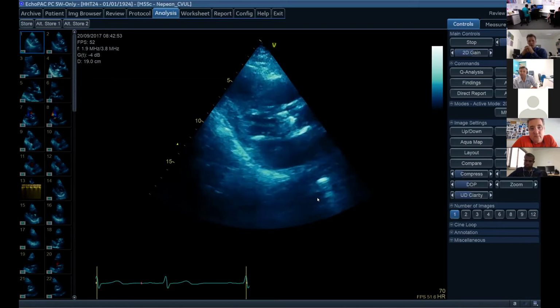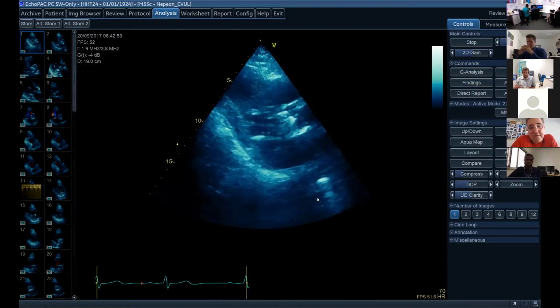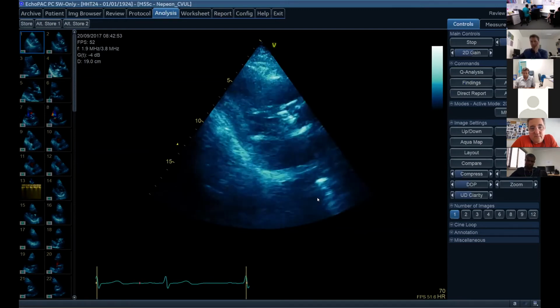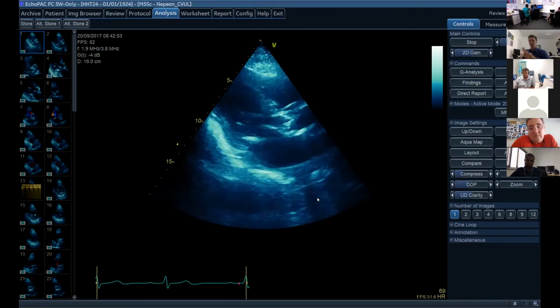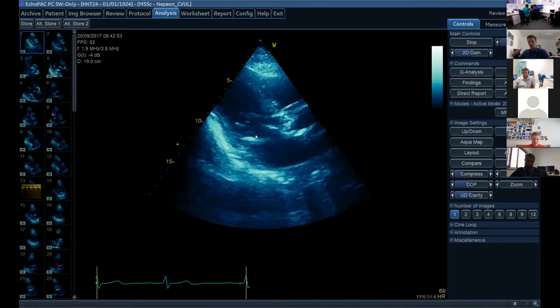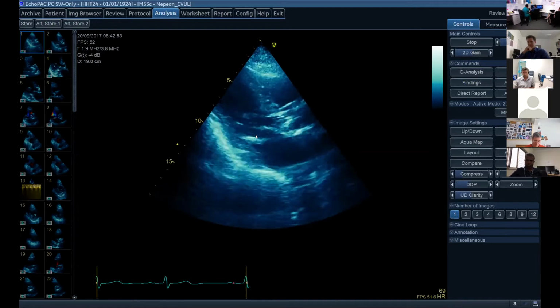Yeah, nice. Keep going. Apart from that, the left atrium might be a bit bigger. Yeah, good. What's all that indicating? So you've got thickened LV free wall, you've got an enlarged left atrium, we've got this very calcified aortic valve, and I think we're seeing some calcification on other valves. So what does that all start telling you? So my suspicion will be LVOT obstruction, mainly at the valvular level.